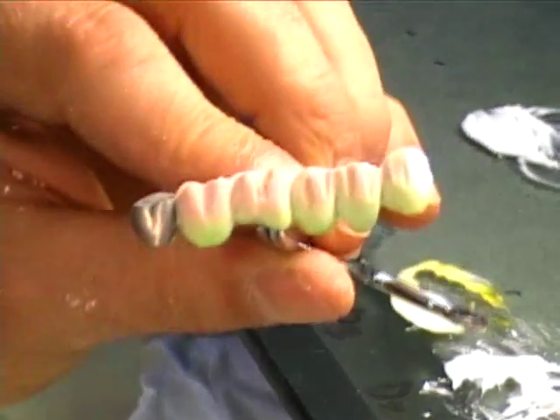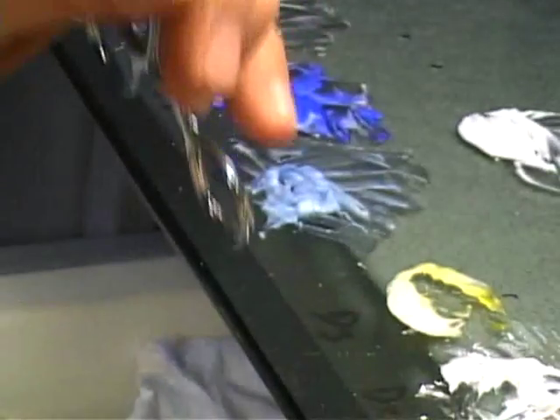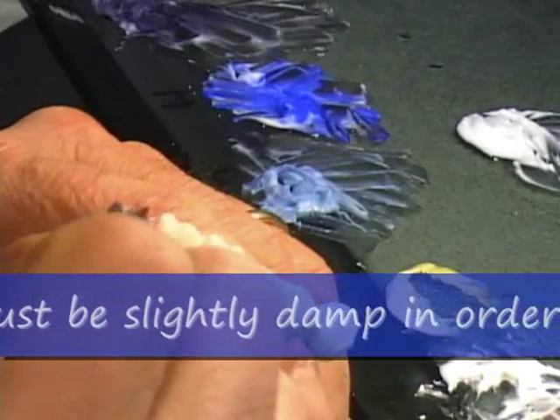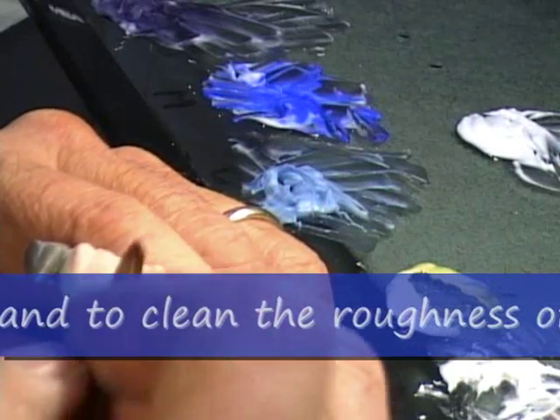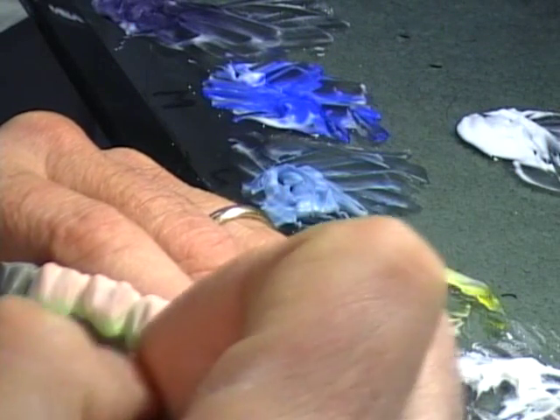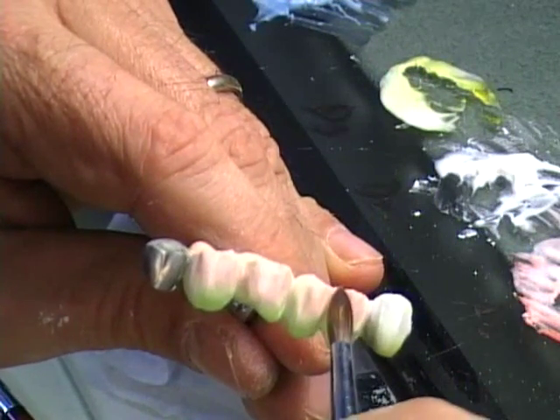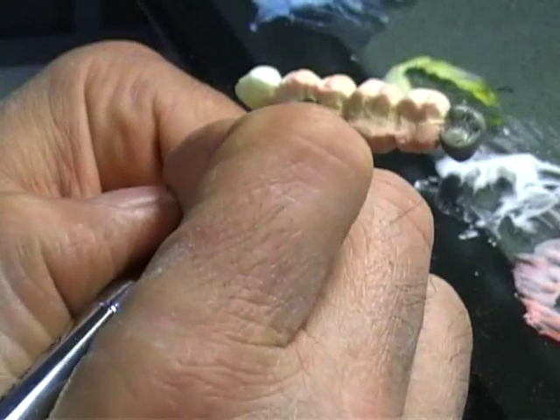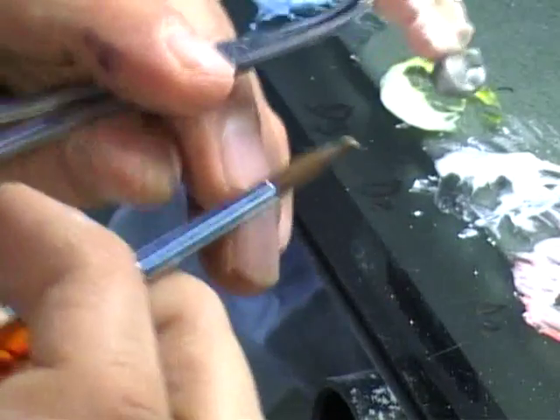Now we can just do a very light wetting and I use my number four brush. I'm wetting a little bit my areas and I'm ready to come in with my enamels. I'm going to find a slightly humid surface so they can just stick on it.